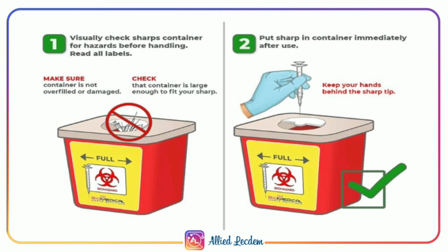Keep your hand behind the sharp tip. Keep your hand like this. This is the correct method.